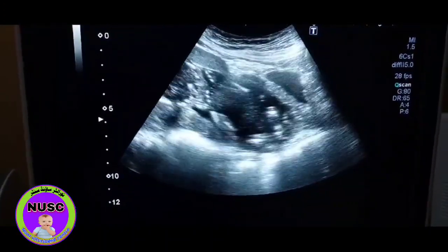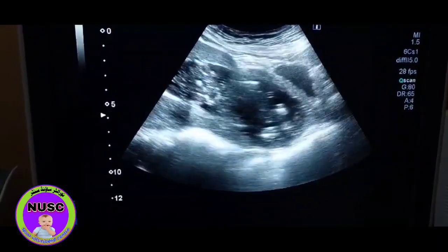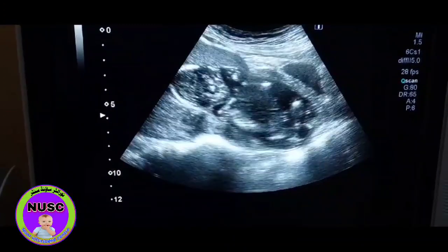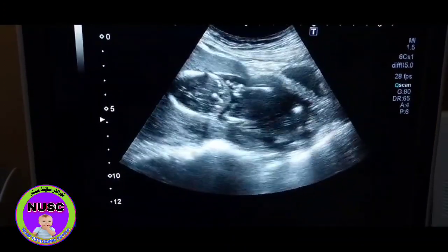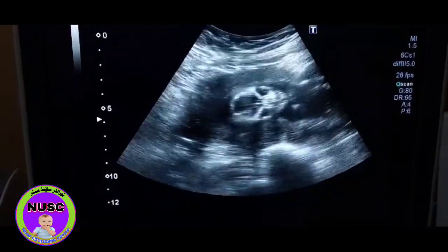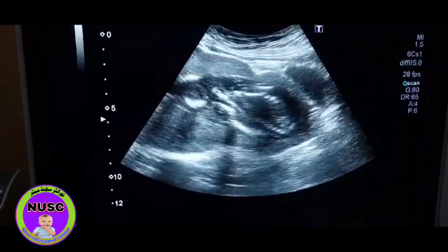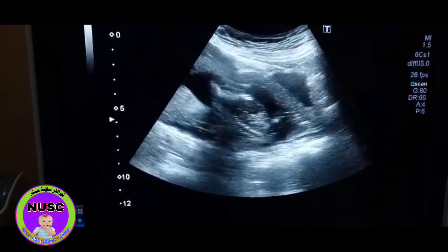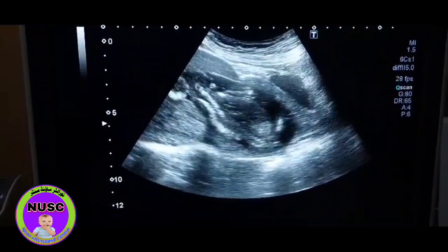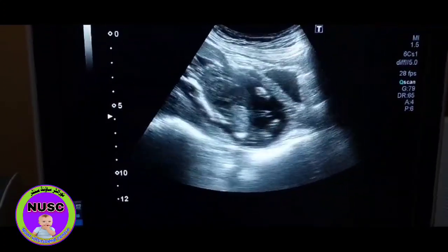The cervical canal is maximally dilated. This is an incompetent, widely opened cervix. In my opinion, this fetus is also going towards miscarriage. The cervical canal is not closed.